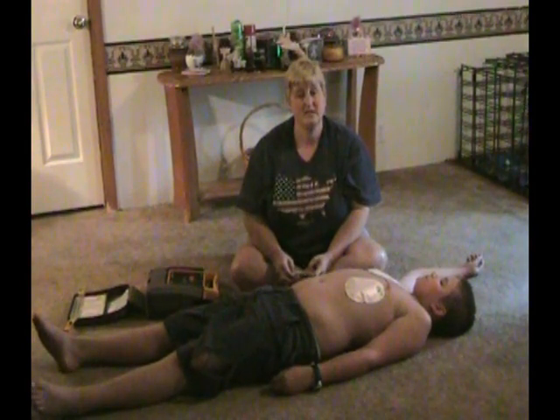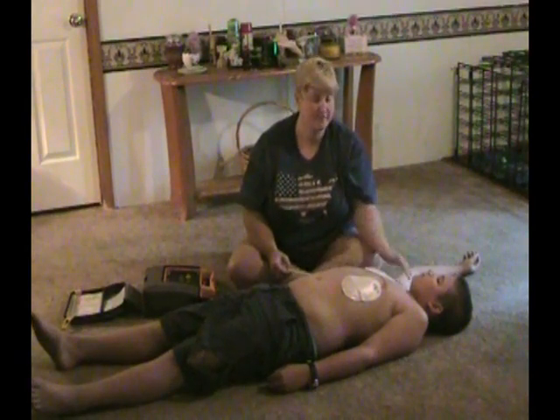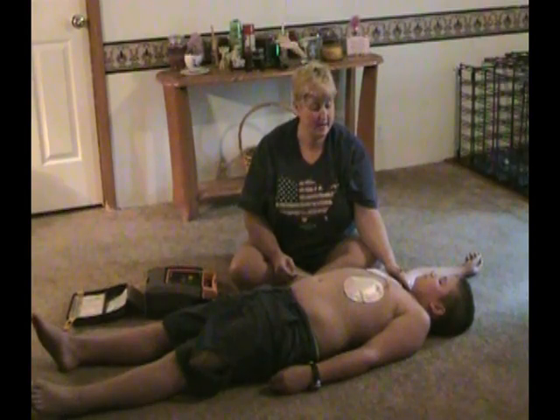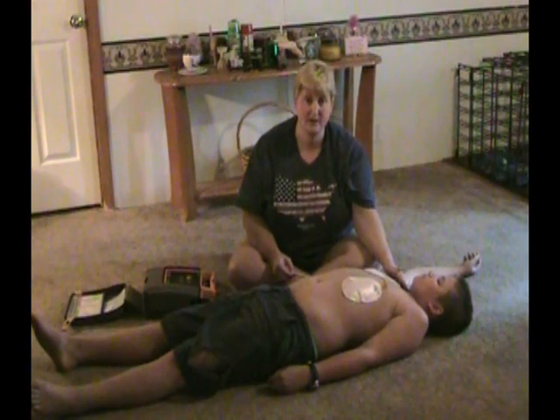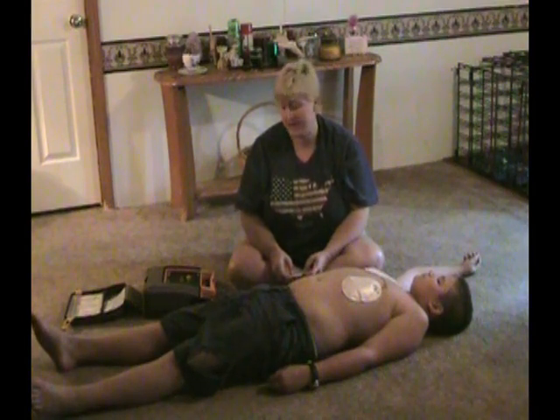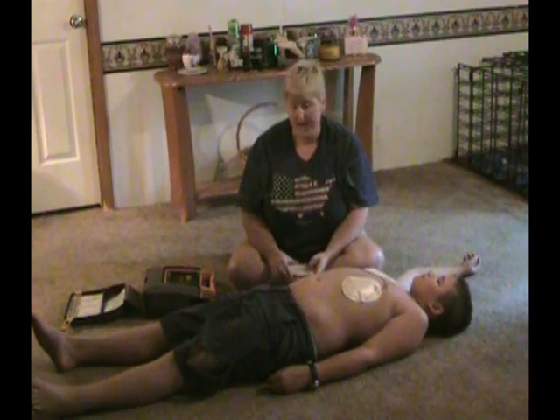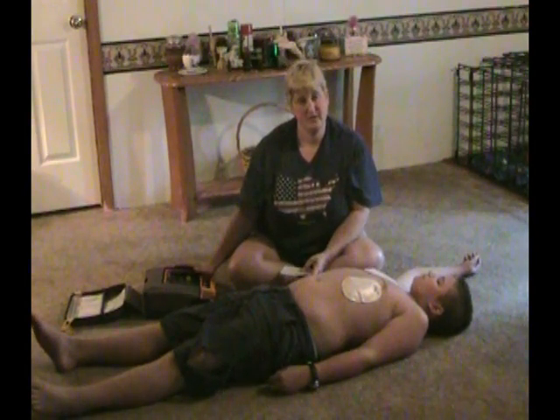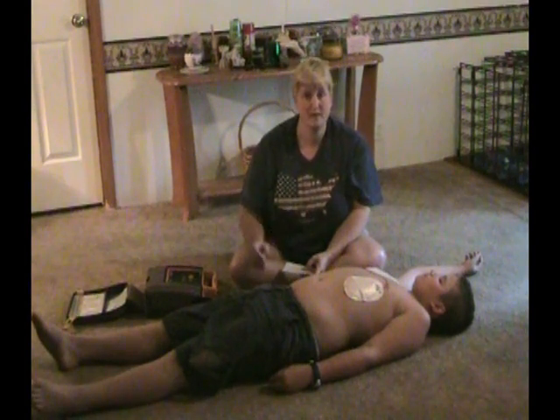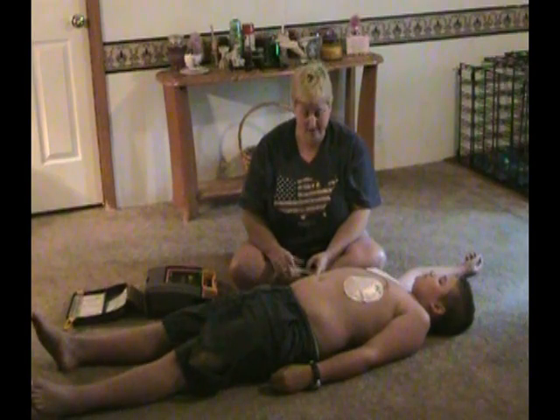If it would have given us a no shock advised message, it would have instructed us to check for a pulse and give us a few seconds for that and advise us to start CPR. It would give us 60 full seconds to provide CPR, and it would ask you to stand clear and analyze again. Every step that this machine tells you to do, you need to follow until number 1, the victim becomes responsive, or number 2, emergency medical personnel arrive to take over care.